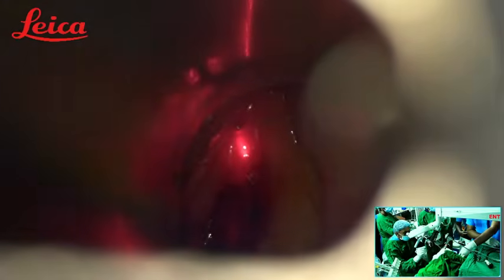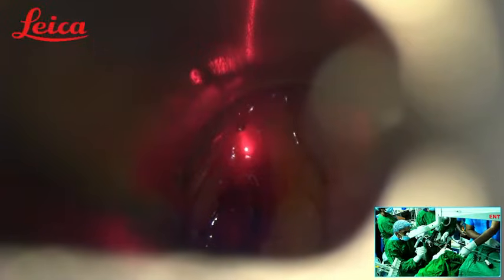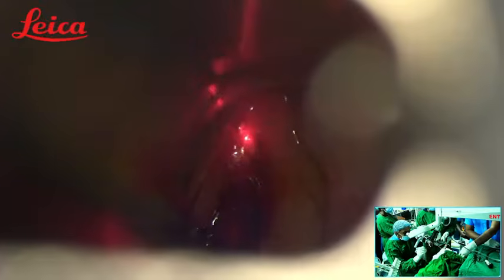Sometimes while you are doing a procedure, the laser light will go out of your view. So the best way to identify it is to reduce the intensity of the microscope light and then search for the beam. Once you get the beam, then you can switch back to the intensity.